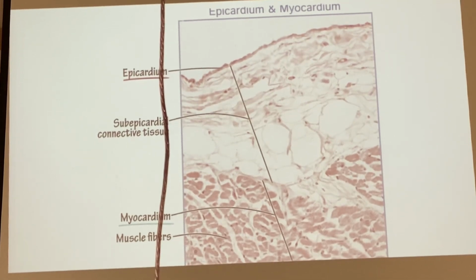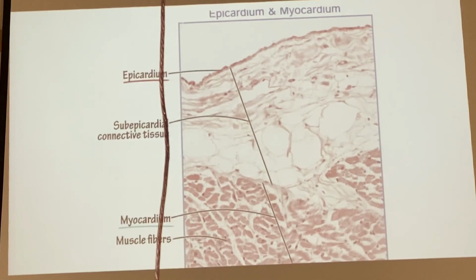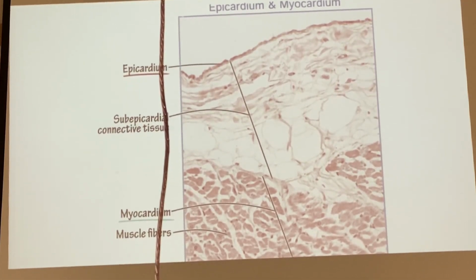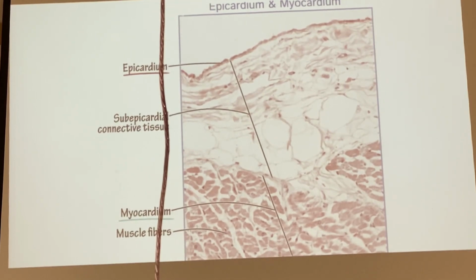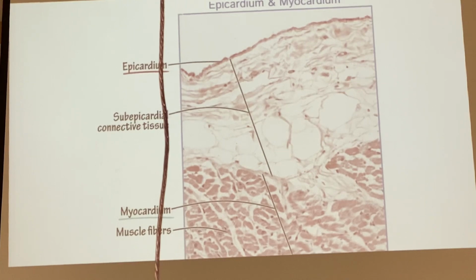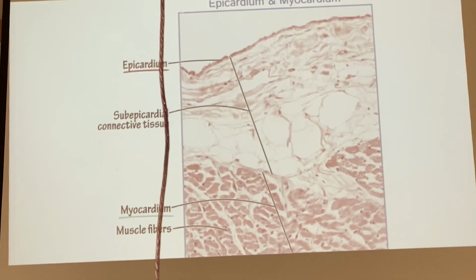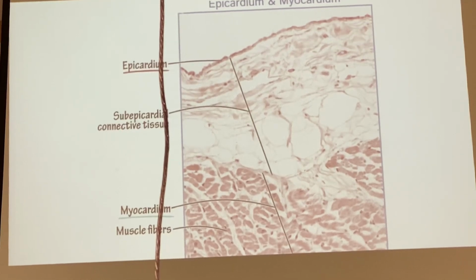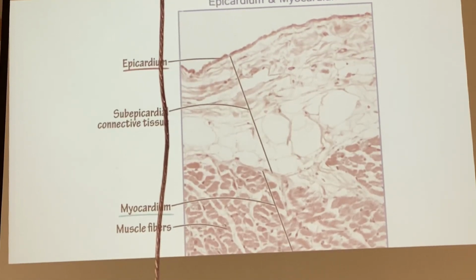Pericardium is a fibrous sac in which the heart is pumping or beating, and the lining epithelia is mesothelium, parietal on the wall of the pericardial sac, and visceral on the wall of the heart, which is forming part of the epicardium.